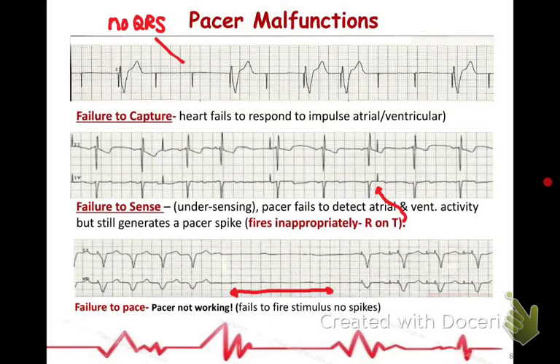I just made some notes there. You've got no QRS on the top one. On the middle one, see how it fired on the T wave there? And then at the bottom, I just drew a line where it shows that it's not working.